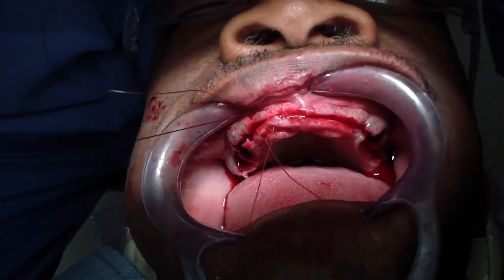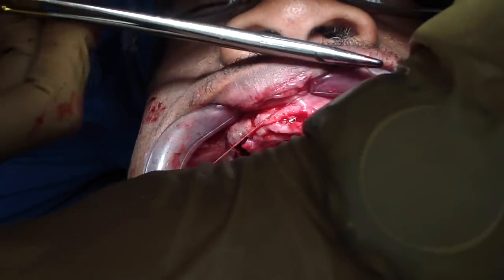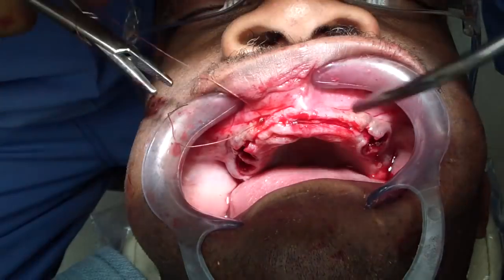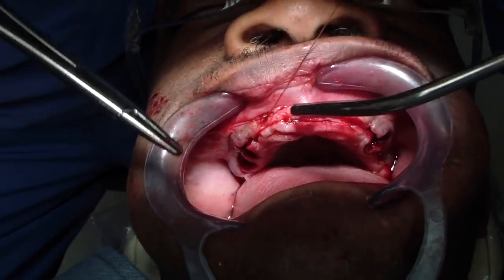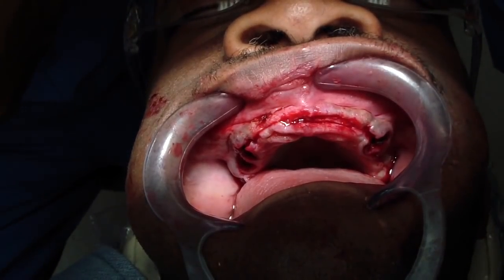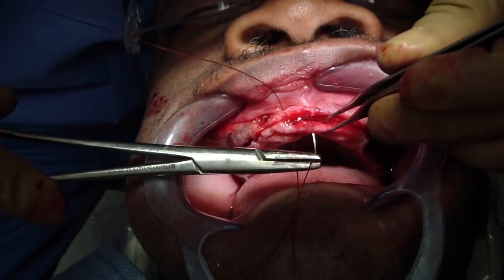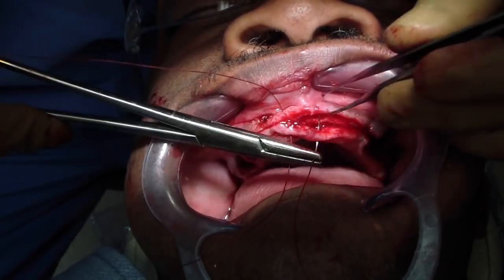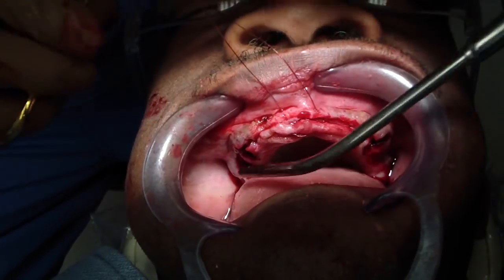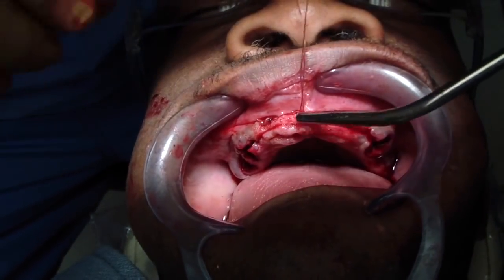This next segment, you see me suturing, but I really want to talk about excess soft tissue. Once you do the osseous recontouring — and we did a significant amount — there is going to be a significant amount of excess soft tissue. Peterson recommends, and Dr. Partridge also talks about, removing that excess tissue. One clinician I spoke to suggested not to worry about it — it will resorb back and heal to where it needs to be. But the problem with that is it increases the amount of time for healing.